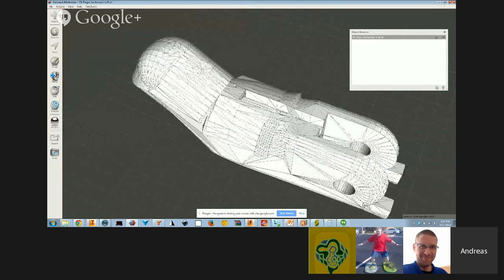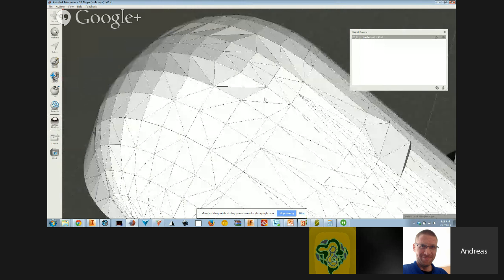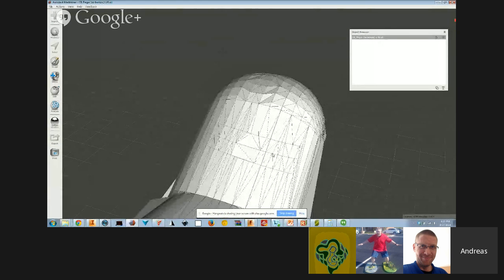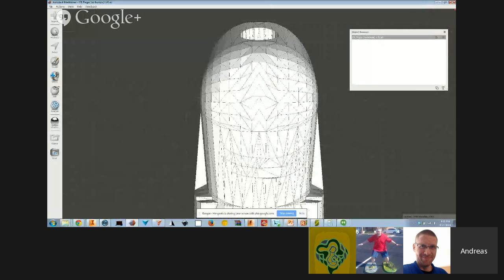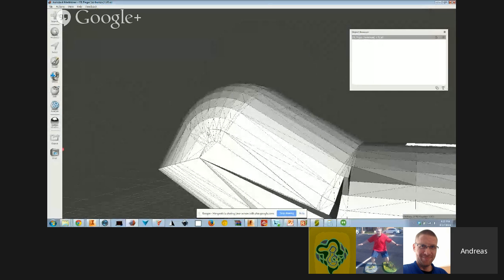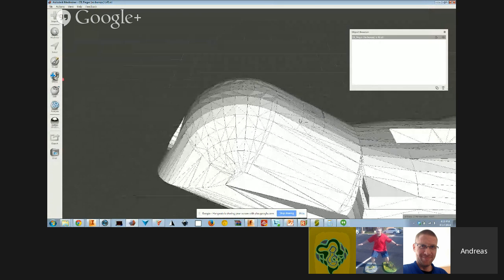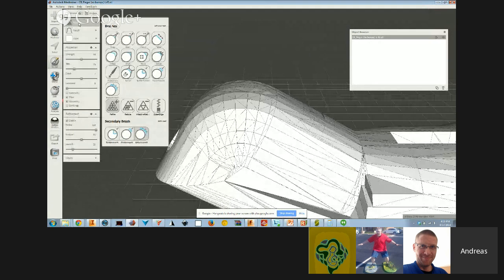Anyways, if you look at this finger, there's not too much resolution here. It's probably coming from a solid modeler or something like that that did minimal tessellation. Meshmixer likes a lot of triangles and tessellation. So one thing we can do is, let's say we wanted to add some sort of texture, like just the default bump or something like that on the tips of these fingers. What we can do is go into our sculpt tool, and I'm just going to show what happens.